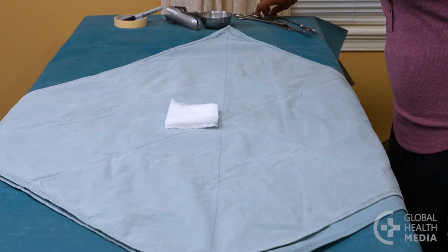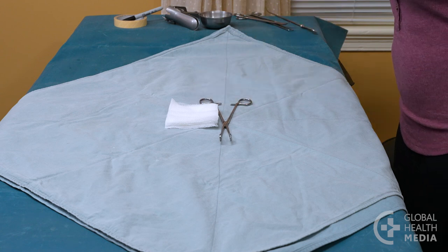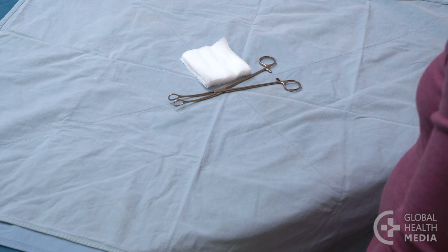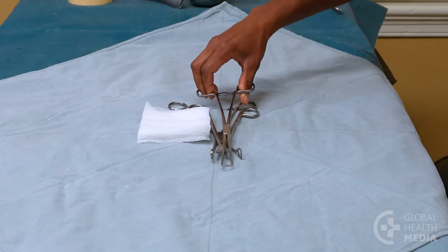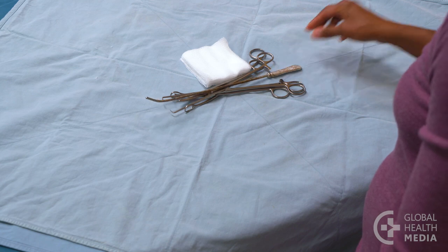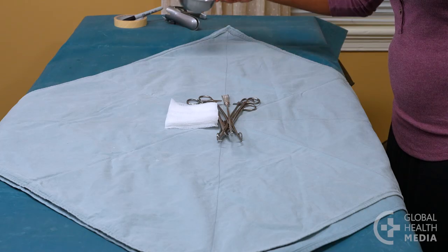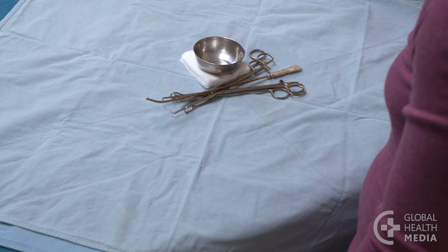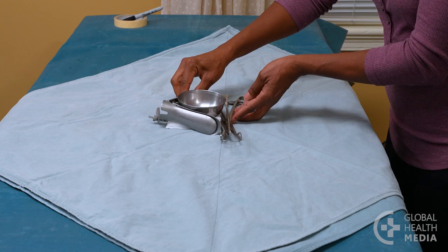Next, place your instruments. Be sure each is unhinged — they should not be locked during the autoclave process. The ring forceps, scissors, tenaculum, and uterine sound are together in front of the gauze and parallel with the edge of the table. Place the metal ball on top of the gauze. Then place the speculum so it curves around the ball and sits comfortably with the other instruments.